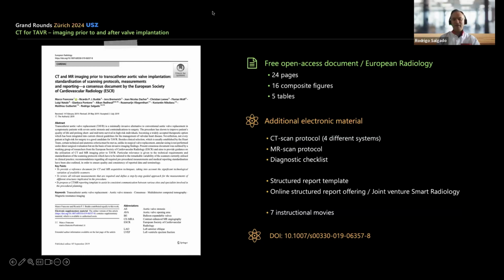I know of centers that do give beta blockers, but I think it depends on the local experience. We don't have the custom to give beta blockers or any medication to TAVI patients. Maybe we are too careful, but that's just how we are. We like to send the patient live and well back to his room. But I can imagine that there are other people who have good experience giving medication under supervision to lower heart rate, and as you saw, also increase image quality, not only of the valve but also of the coronary arteries.